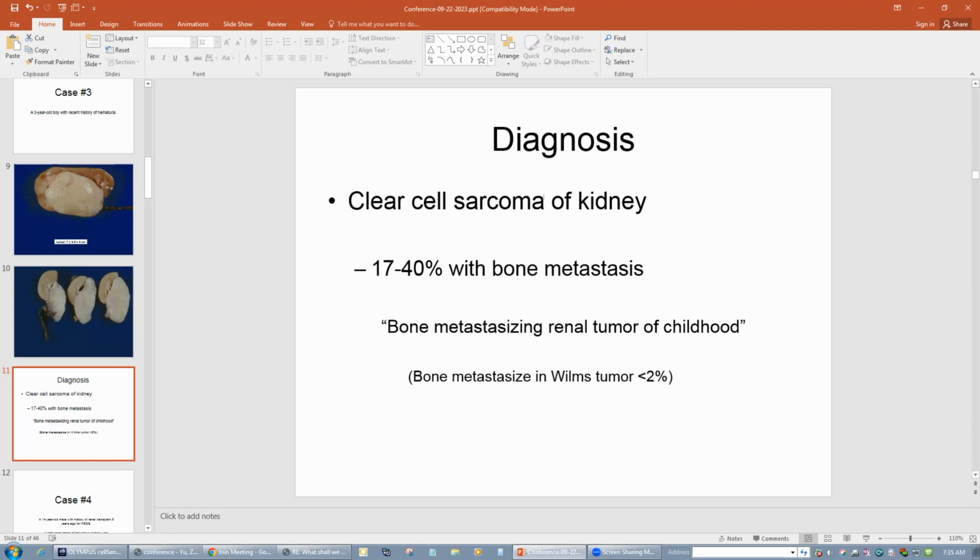So I want to say about this: BCOR mutation, and another one is YWHAE and NUTM2 fusion, that's a gene change. The majority, I think they said if you do BCOR immunostain, 100% should be diffuse strong positive. It's a very useful marker. This is a malignant tumor, need to treat. So recognizing this one is very important because they need chemotherapy. Any question about this one?